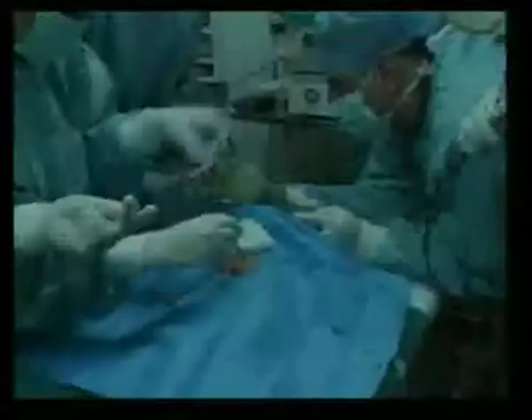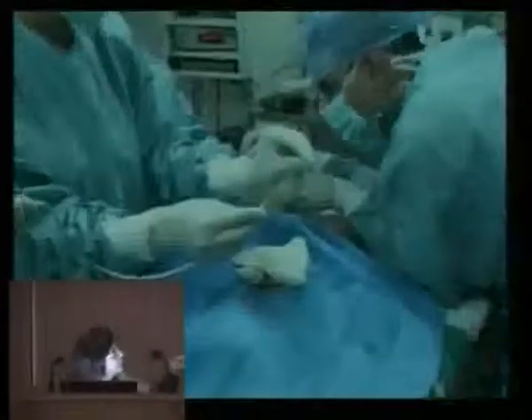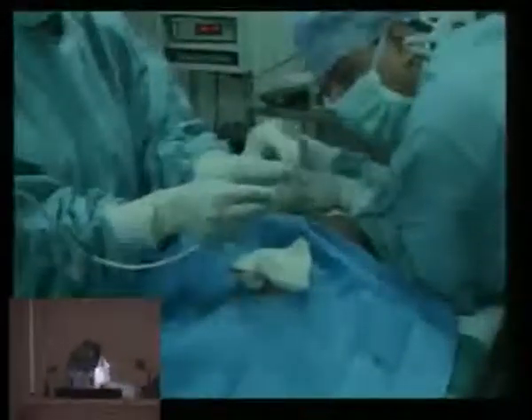With the needle and the forceps, we put in a wire through the tube that we had put. That was the wire, and this is the wire we are putting in. Now the same wire, I'm going to hold it from inside. That's how we hold the wire from the inside. Obviously when I'm doing this, I have to have a good anesthetist or a good guide who's doing the resuscitation, so I don't have to be looking into that part. Having done that, once the wire has come out, we knot this.